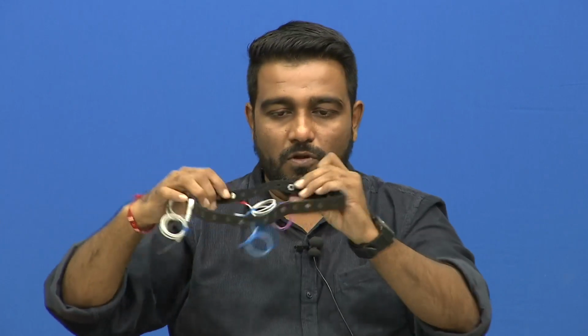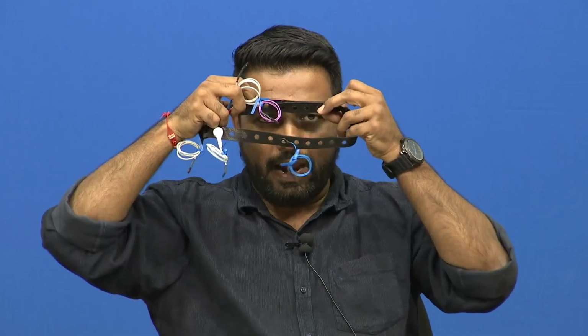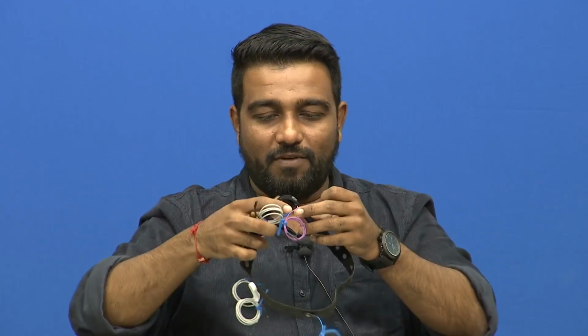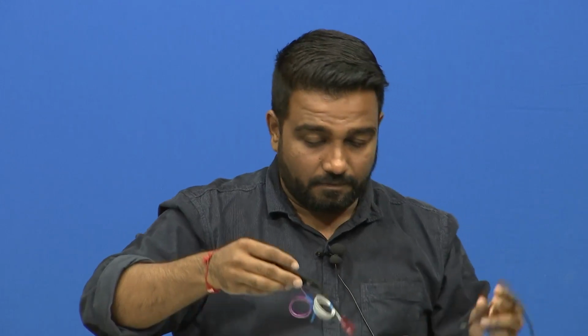Of course, there is a holder to hold this electrode, like I have shown you earlier. Okay, let me show you the headband, so it becomes easier. You see in this headband, here is a dry electrode, right. If I put the headband on my head, of course, I have to wear it, I can wear it right now also. Let me show it to you guys.